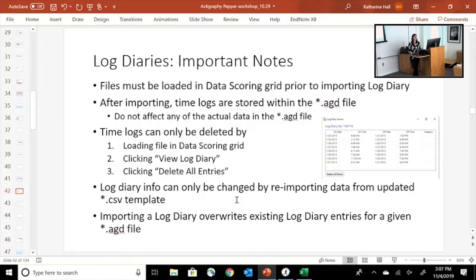Yeah. I know we're talking about patients recording their wear time, but another instance where it did help was, for instance, when we collected the monitors from the patients, the clinical research coordinator did walk with the monitor to download the monitor. So it was still actively collecting data, but by having a log of when that research coordinator actually picked up the monitor and said this is the time that the patient stopped wearing it, then we were able to have Catherine delete everything else that was extra information.